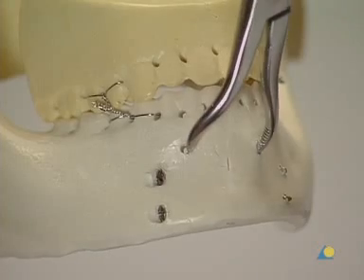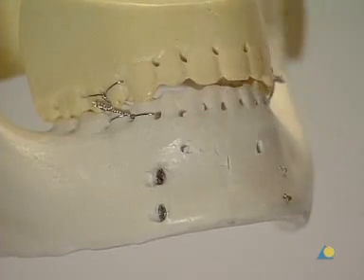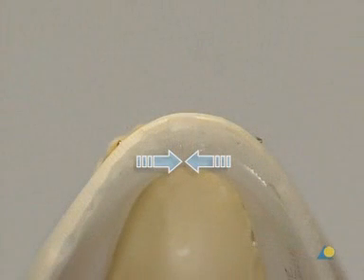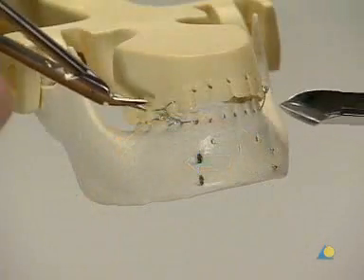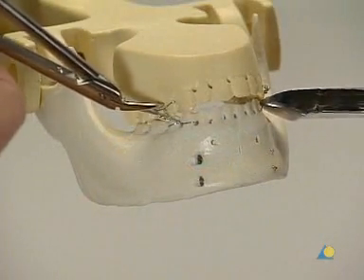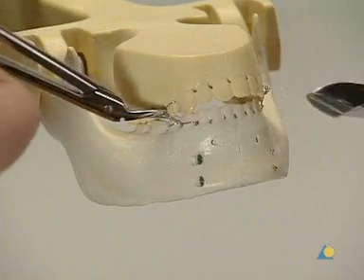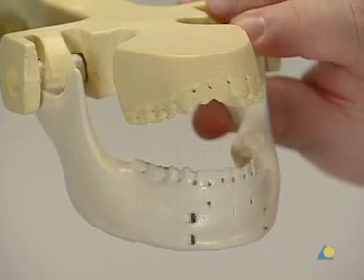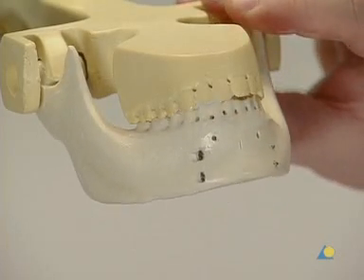The reduction forceps is removed. Adequate reduction is confirmed and the fixation is complete. There can be no gap at the lingual aspect that would lead to occlusal disturbance and mandibular widening. The Ernst ligatures are removed. The mandible is now functionally stable.